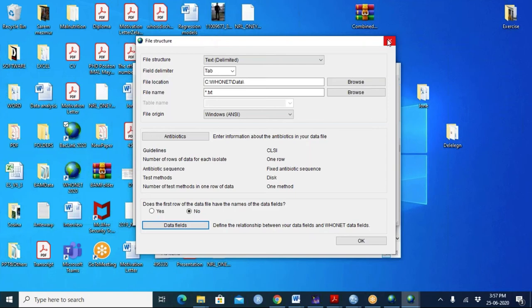But your question is extremely appropriate for this Backlink configurability option. As another example, you talked about creating a new column for the age group. And yes, Backlink can then capture your column for age group. That would completely satisfy Fern's question, where you make the age group on your own in Excel before it gets to WHONET. We'll allow you to do that inside of WHONET later. So that's one example.